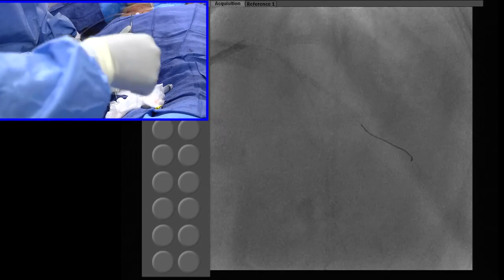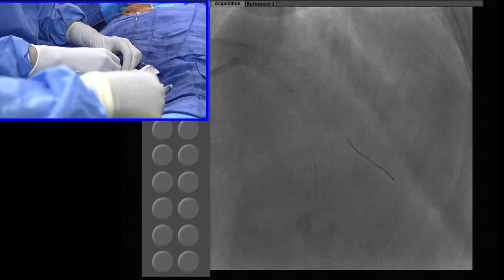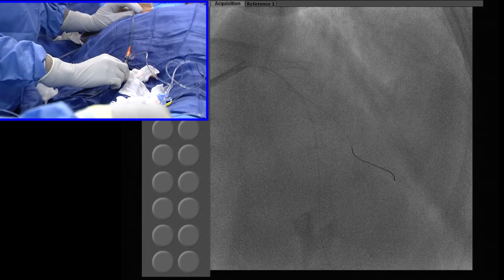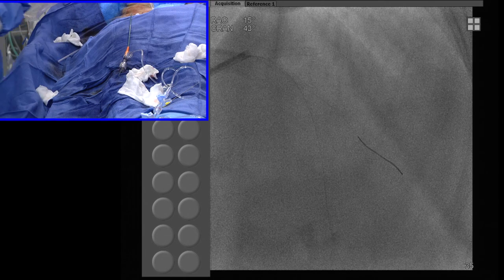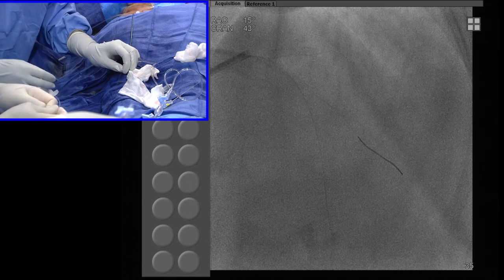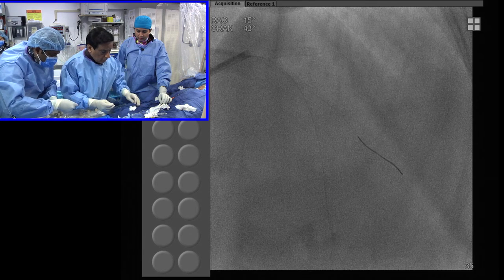In last month's case, I had observed and almost predicted that you will always do very well with BVS, because I have not known any site doing more lesion preparation even for routine cases. Yes. And I think particularly the use of rotational atherectomy for the calcified cases will make it so much easier. But one thing for sure we are noticing: in a very tight lesion, even if you do rotablation, you really cannot bring the residual down to 0%.